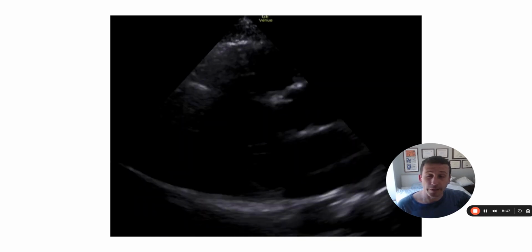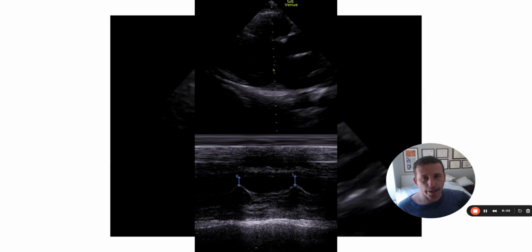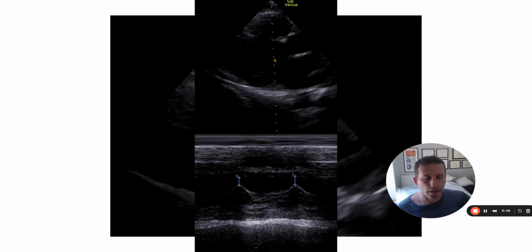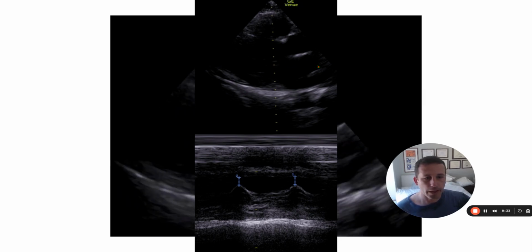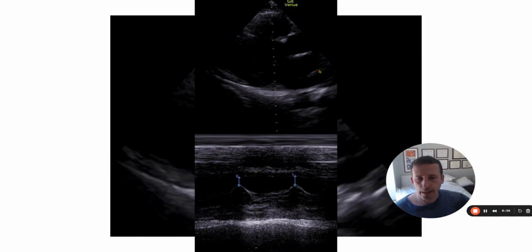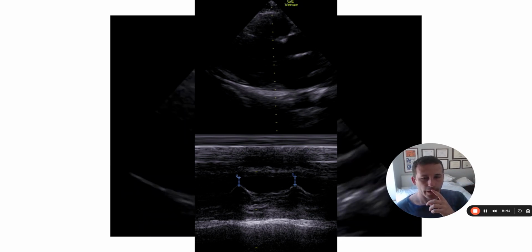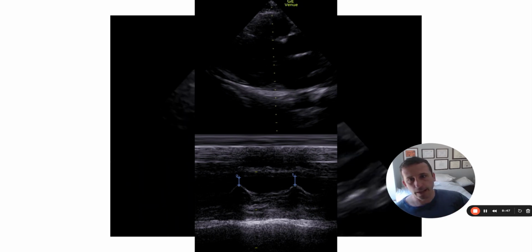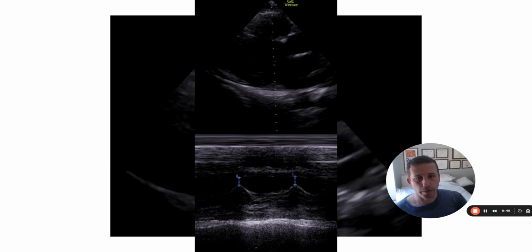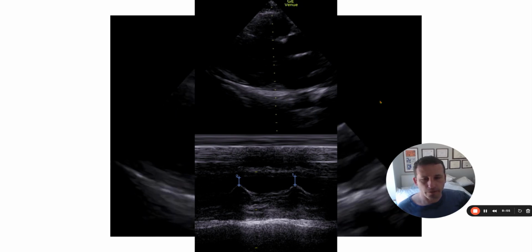So one other method of assessing left ventricular function is called the EPSS, or E-point septal separation. What we're looking at here is dropping that M-mode line where that anterior mitral valve leaflet is. What we want to see is how close that leaflet comes to the septum each time it swings open in diastole. If it's coming within 7 millimeters, so less than a centimeter, then that's typically indicative of a normal EF. If it's greater than that, and my loose cutoff to improve specificity is 1 centimeter, if it's more than that, then that typically indicates you have reduced function.